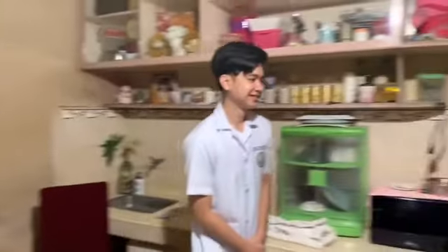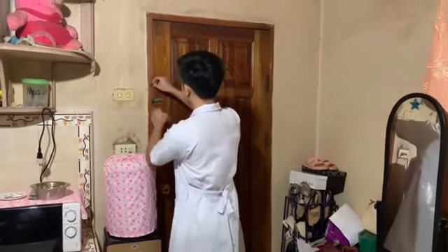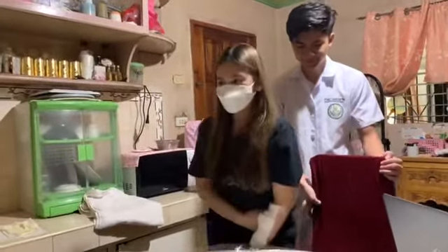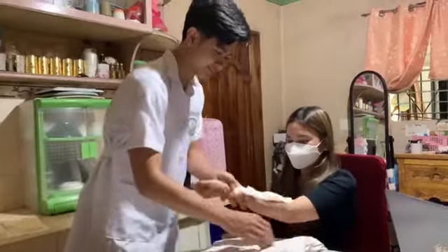Close the door or the curtain. Use a bath blanket as needed when exposing the area to be dressed. Closing the door or curtain provides privacy and warmth. Assist the client to a comfortable position that provides easy access to the wound area. Consideration for the comfort of the client is a primary concern. The nurse promotes good body mechanics to avoid muscle strain.